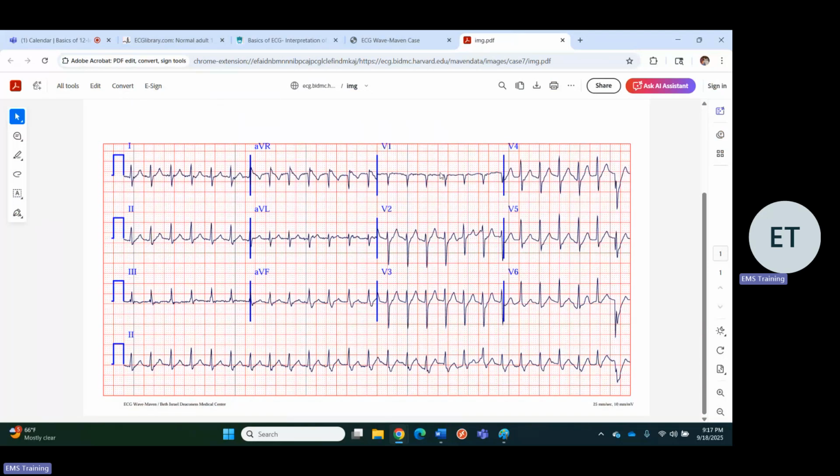Okay, let's do basics. Normal? Nope. Slow or fast? Fast. So abnormal and fast. Any hemodynamic symptoms with this patient, I would immediately begin to investigate why. I would immediately try to determine is this primary or secondary cardiac. Primary cardiac, at this rate? I don't know. But it's faster than 150. And it's irregular. Looks like AFib.